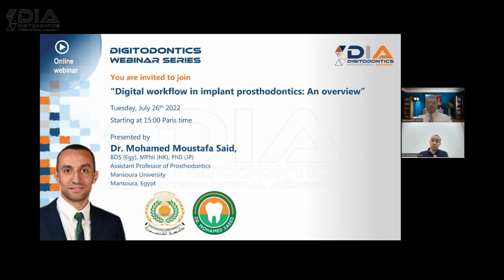We move the STL file of the surgical guide to a printer, and we print the surgical guide with very high accuracy, and then we could use it in the surgery for implant placement. So some of this software is really a huge advantage, and I advise everyone to try. And there are many tutorials on YouTube that will teach you how to use it and make your design.